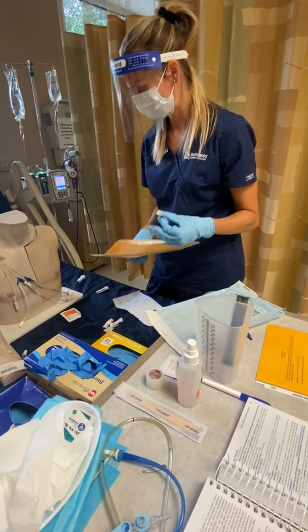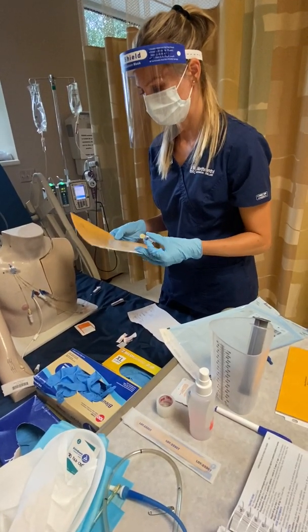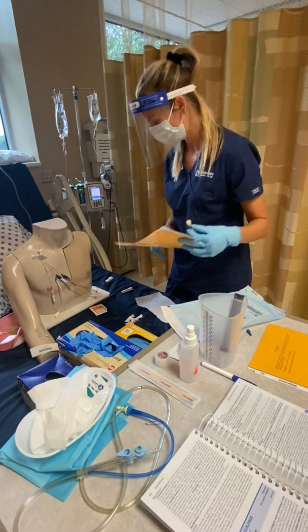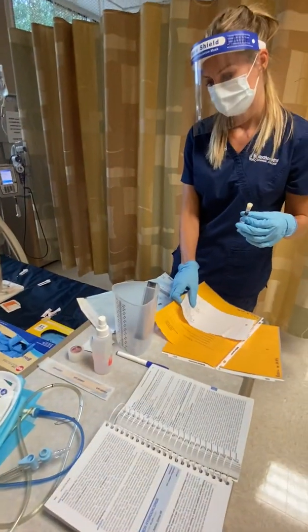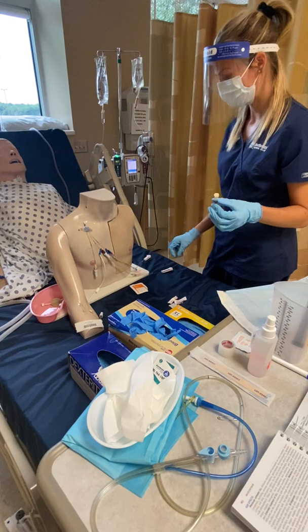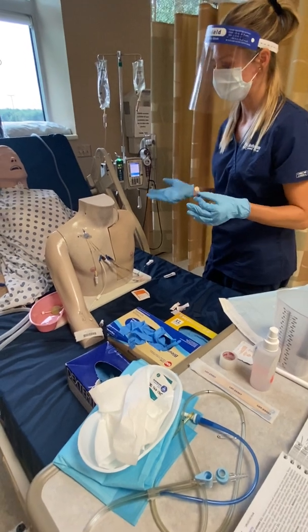She is going to be getting that IV push through her central line, IV bolus, and she has not had it at all yet in the last 8 hours. So, all right, I'm going to set this over here, Jane. Now, I know you're feeling nauseous, and this should help with that. Some side effects of this medication will be dizziness. That's one of the main side effects.